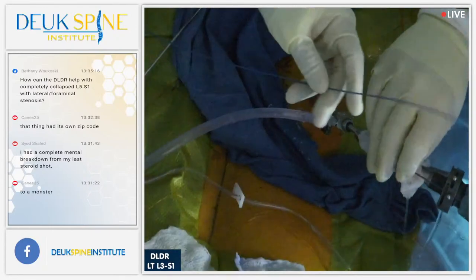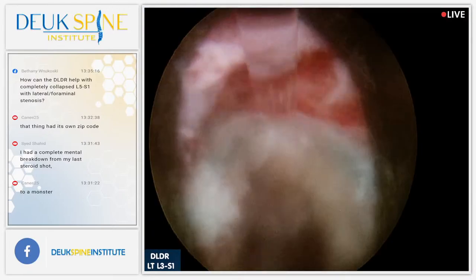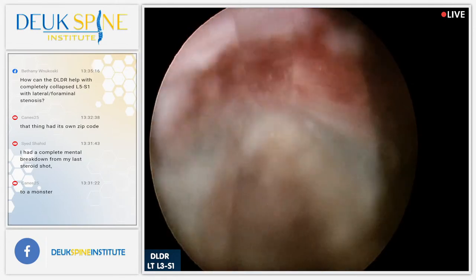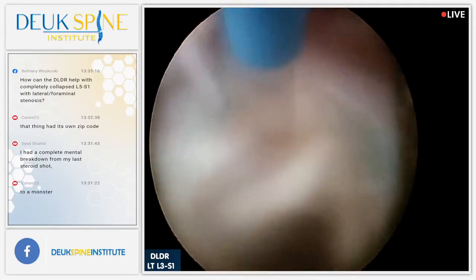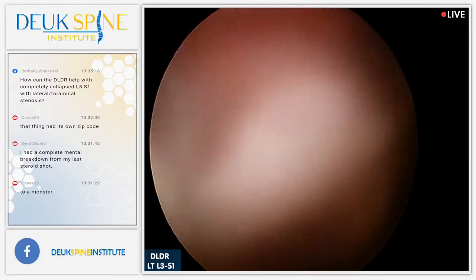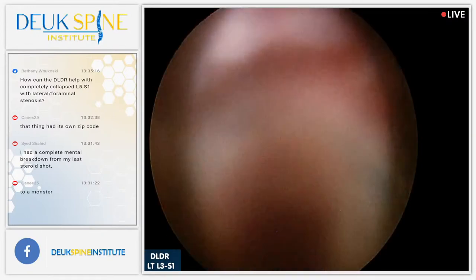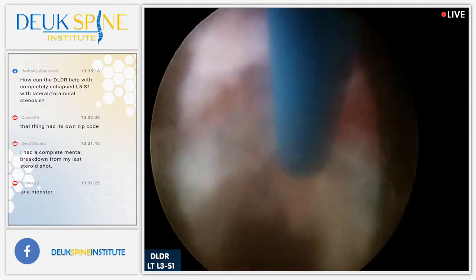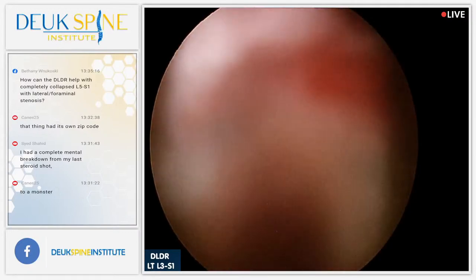You guys can see the scar tissue right there. You can see the fat in the epidural space, the foraminal ligament right there. Just about done at this level. I need one minute on this level and we'll be done, doctor. Got a piece of herniation in the way. All right, I think we're good.